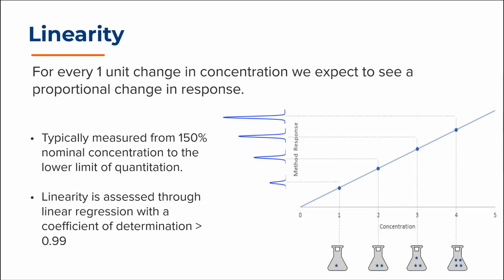The most common assessment of the quality of the linear fit is the coefficient of determination, or R squared. This value is computed based on the errors calculated for each variable in the fit and the cross terms between those variables. The resulting coefficient can be interpreted as follows. If you achieve an R squared of 0.939, that means that 93.9% of the variation in the detector response can be explained by the variation in concentration.